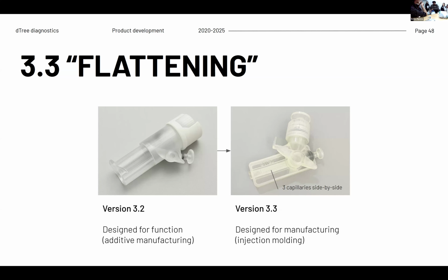So why? Does anyone have any guesses on why we have to have this little bit of extra? This is not where the reagents are stored. The reagents are stored on the side. Then what's the red thing? It's not reagent, so just imagine it's empty. So at the beginning it is empty, but we do need that chamber. Does anyone have any ideas?